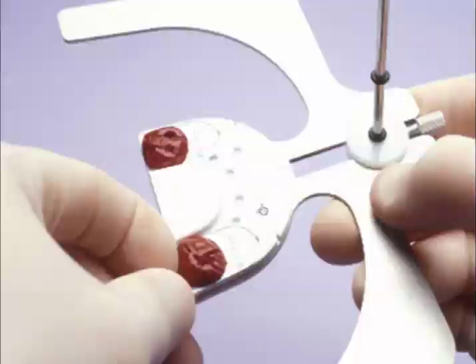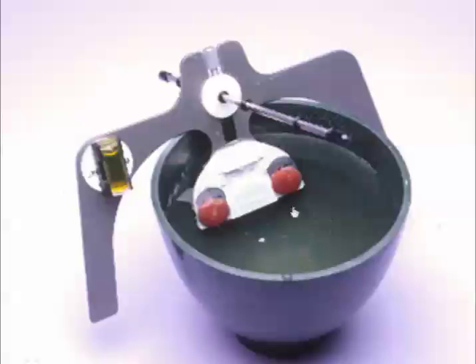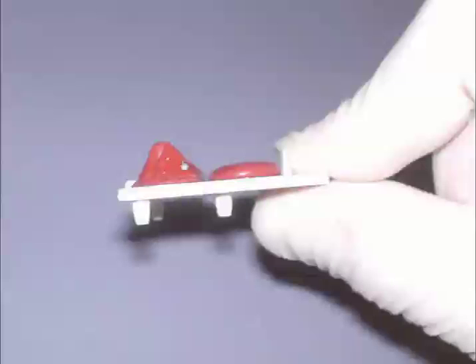We can then add our bite tabs, the red impression compound on a self-adhesive strip. Add 2 back in the molar area, and I also like to add 2 more over the bicuspid area. We can then temper that compound in hot tap water, and once it's softened, we can mold that compound into a cone shape to build more height in the compound, especially if we have a steep plane of occlusion situation. If we had a reverse plane of occlusion situation, I may squeeze the compound in the front up a little bit higher.